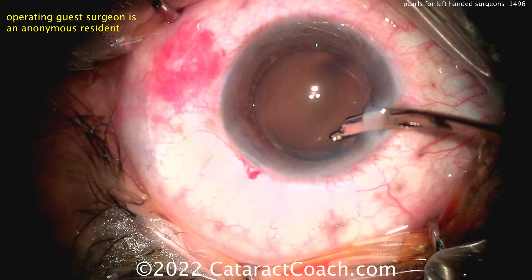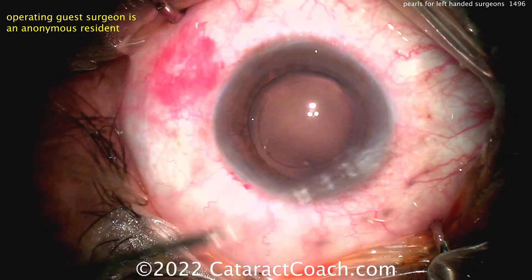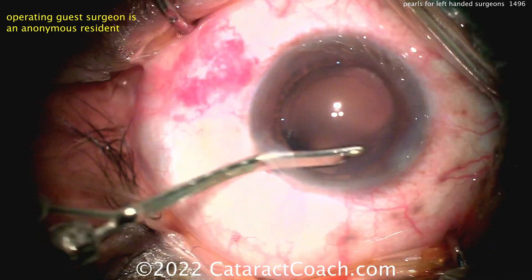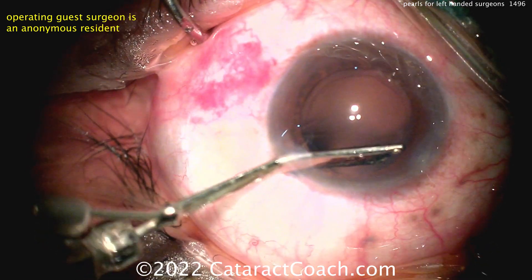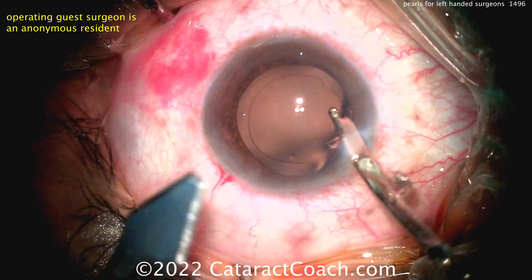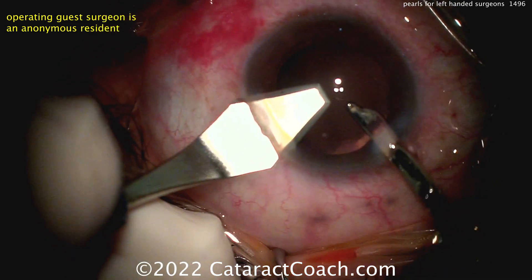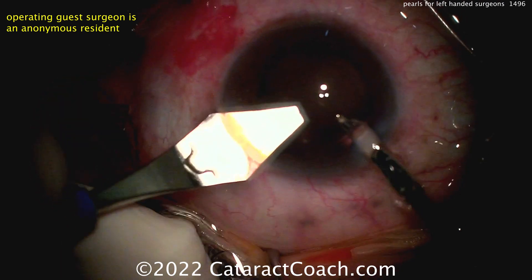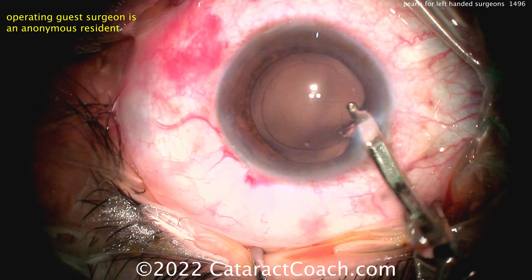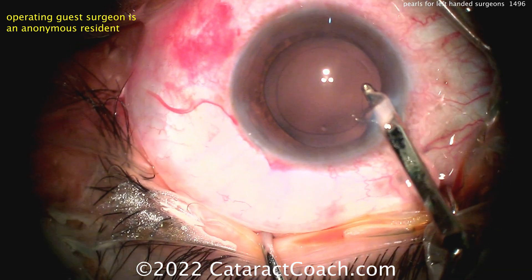You should be able to do cataract surgery with both hands — and that's helpful. Think about this: if you're a right-handed surgeon sitting temporally and the patient needs the FACO incision on the steep axis at 30 degrees, it's very easy to make it with your right hand. But if you need to make the incision at 150 degrees, just switch over and put the probe in your other hand. You'll be able to do surgery with both hands and help a wider range of patients.